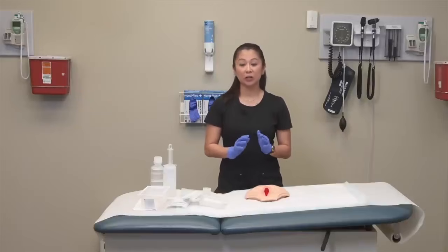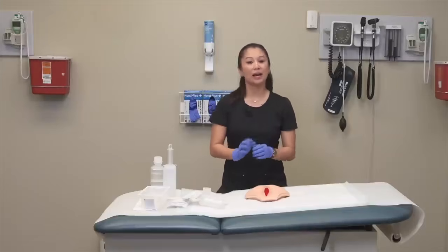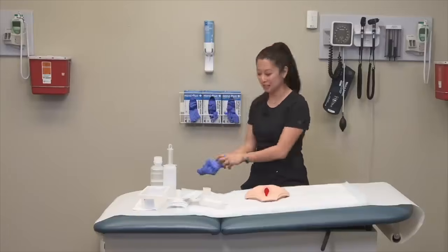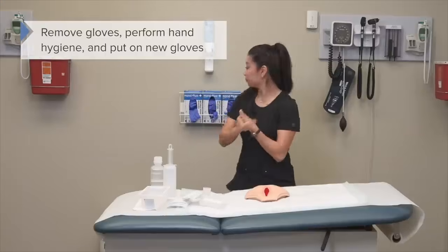So just keep that in mind. Now, once I've done irrigating, this is just me: it's a great idea, since I've been irrigating and my gloves can get wet, to go ahead and change those now, perform hand hygiene, and put on some new ones. I like to do this because I'm touching clean supplies now.